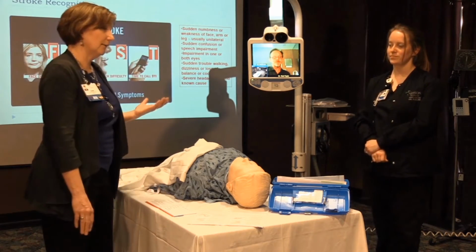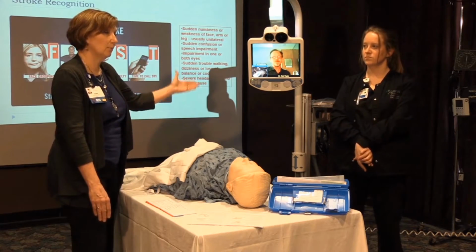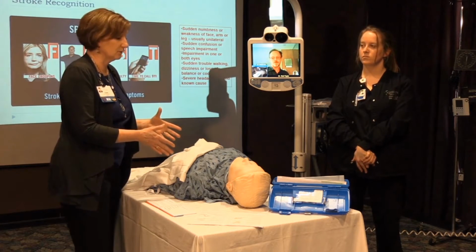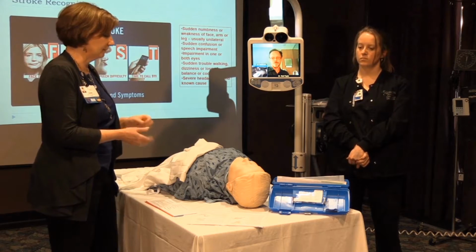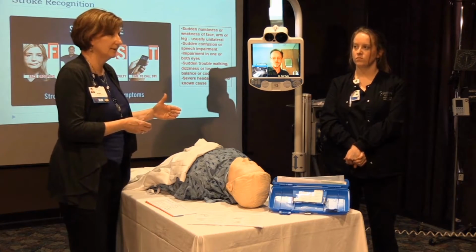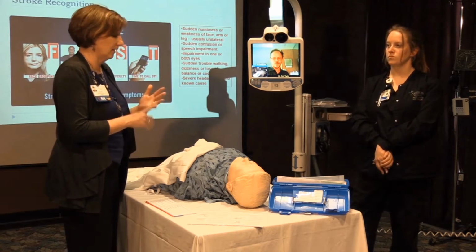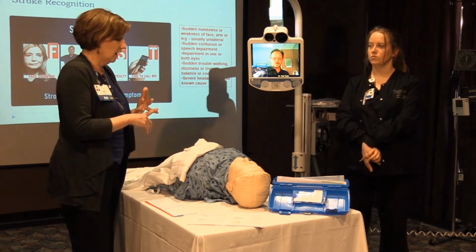So I think Dr. Taylor has summarized very well for us the interaction of a telehealth provider coming in and joining your team in the treatment of acute ischemic stroke. A couple of things to wrap up this section of our training: you notice that he was able to do the full examination, but with the assistance of a nurse. So I want to reiterate again that we have to have someone in the room to assist with that evaluation.